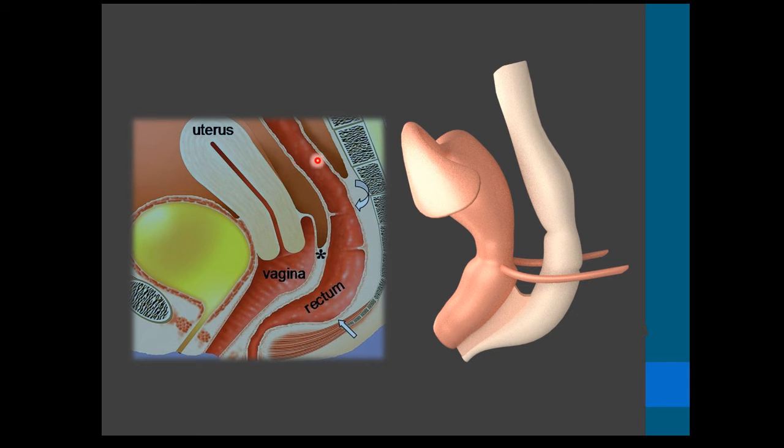And the obliteration usually happens because the bowel is stuck to the posterior uterus, or the bowel is stuck to the posterior vagina. And therefore there is no sliding seen between the uterus and the bowel, but also importantly between the posterior vagina and the bowel. So it is this area here that we want to see nice sliding.